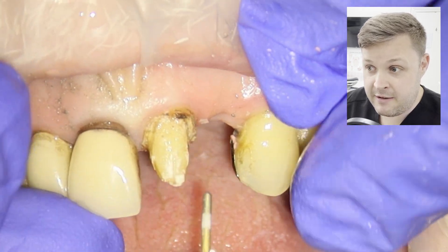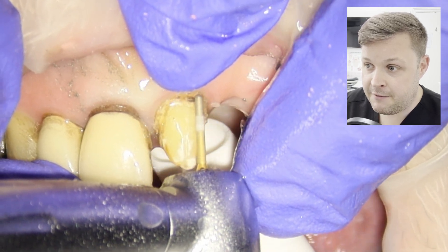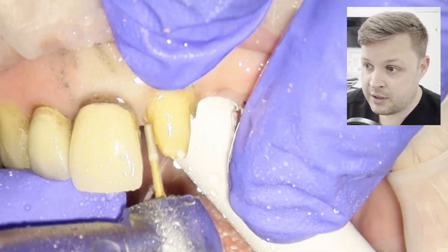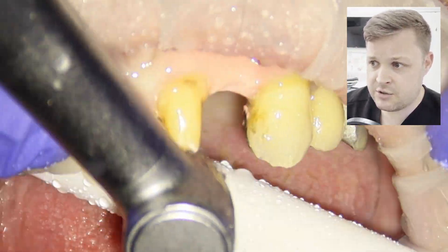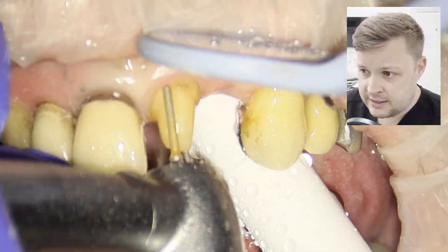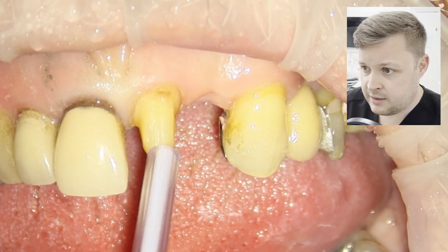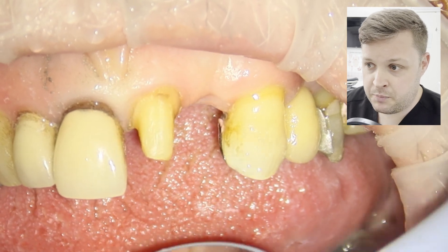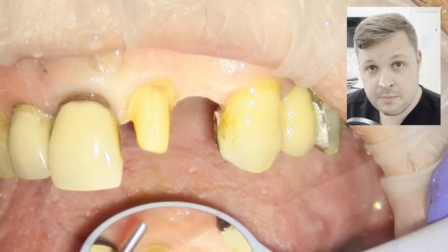I'm going to very gently polish the prep up with a fine grit burr. These are really nice because they have a bit of a rounded edge on them, so you get a nice shoulder. We're just cleaning up — not much prep needed — and I've noticed there's a small cavity on the palatal aspect of this prep.